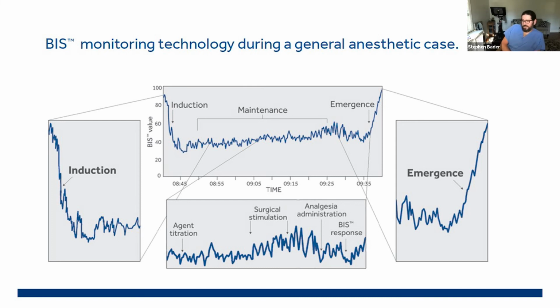I mean, sometimes there are cases where it feels like the splinting and wound dressing takes as long as the operation, right? So there's this long period of time at the end of many cases where the patient still needs to remain still, but there's very little surgical stimulation while they're doing whatever dressing or splinting. And then we can really have that patient just skating along at just sedated enough so that we all look really good and feel really good about having that really quick emergence without having it be premature.